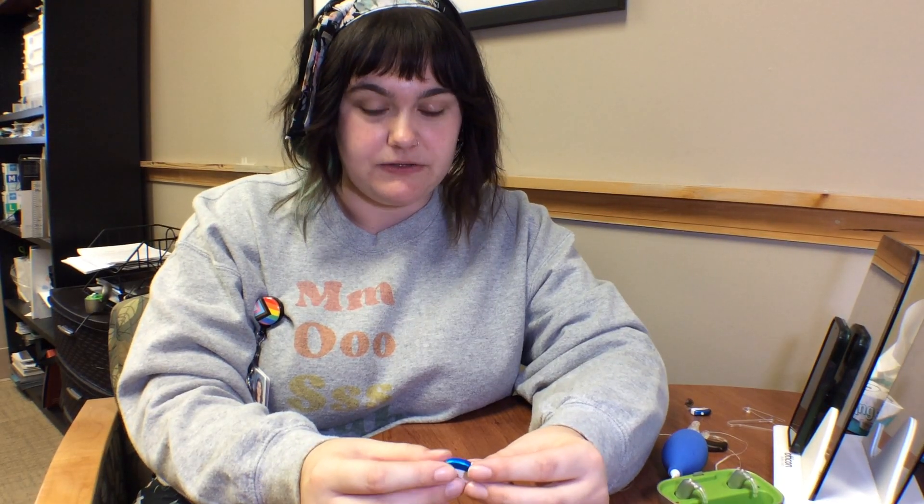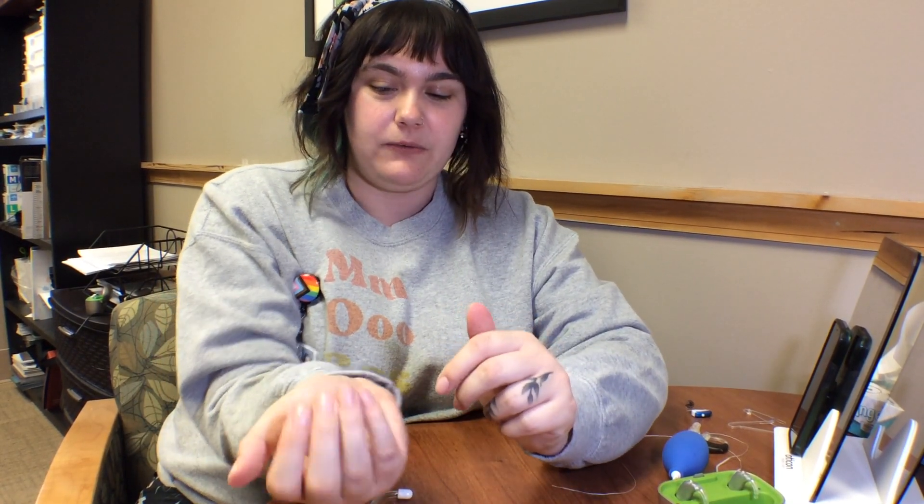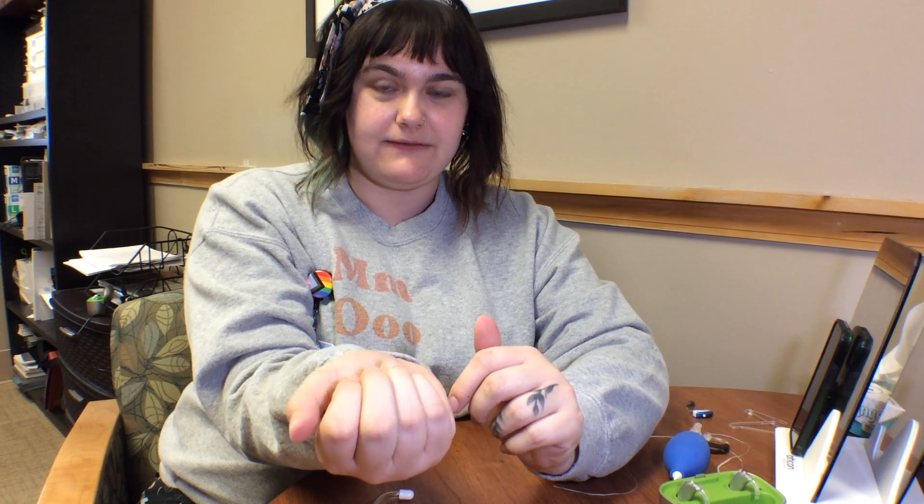The very first thing you're going to want to do is check to see if there's any sound coming out of the hearing aid at all. A quick way to do that is to hold the hearing aid inside your hand and listen for feedback.